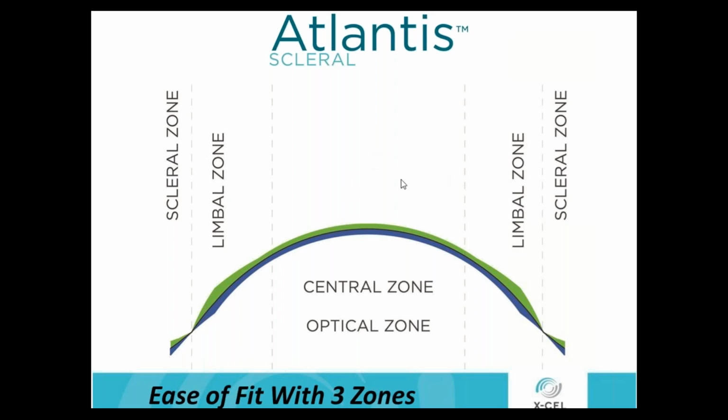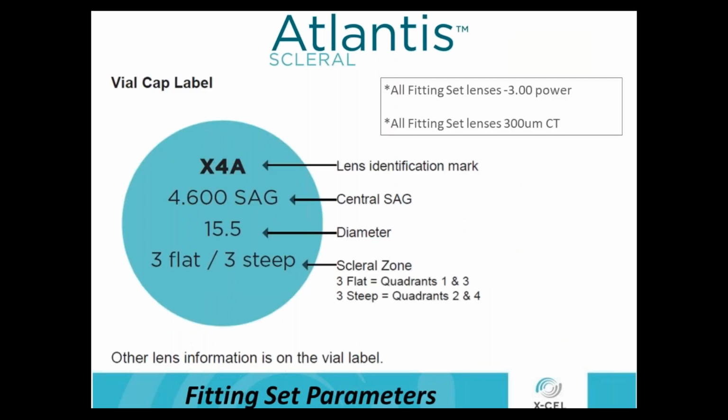If I do my due diligence centrally and limbally with my amount of clearance, I know 99.9% of the time, even after that lens settles, I'm still gonna have my clearance in these two zones. What's the most unpredictable is what happens on that edge. So why I wanna start from the inside and go to the outside and have the outside evaluation last is I wanna give as much time as I can to let that lens settle, all right? We gotta give that time.